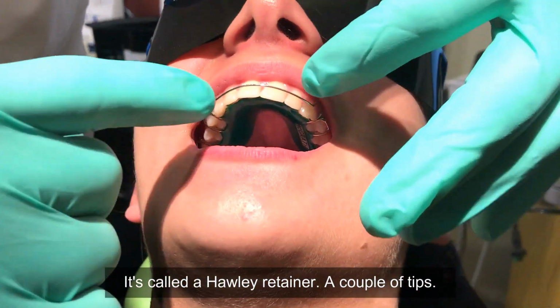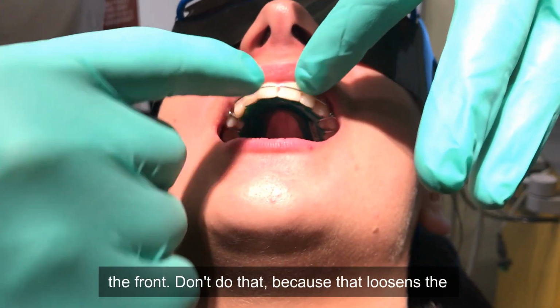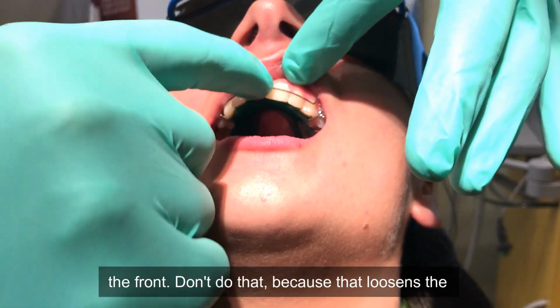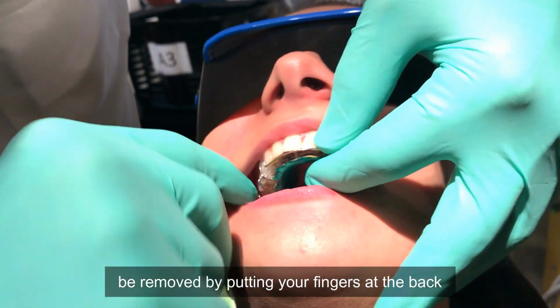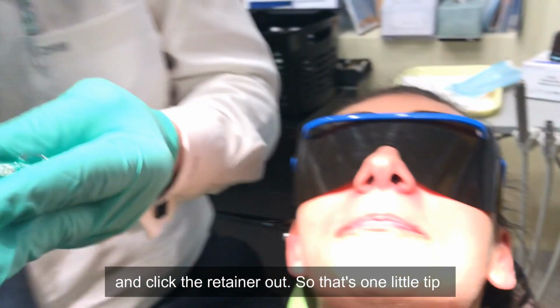A couple of tips. Some children try to take the retainer out from the front. Don't do that because that loosens the retainer, gets it out of shape. Retainer should be removed by putting your fingers at the back and clicking the retainer out. So that's one little tip on retainers.